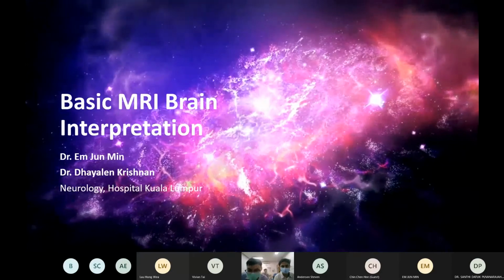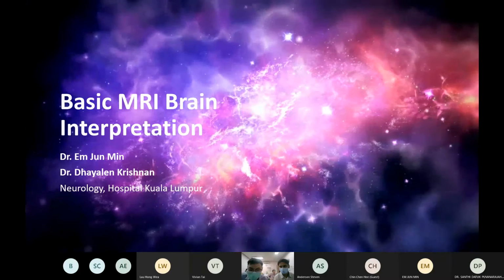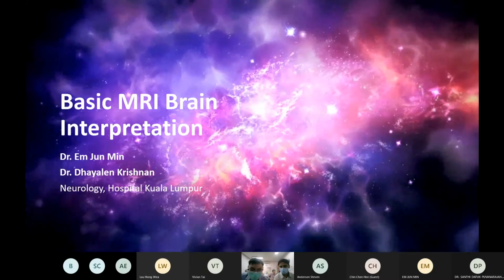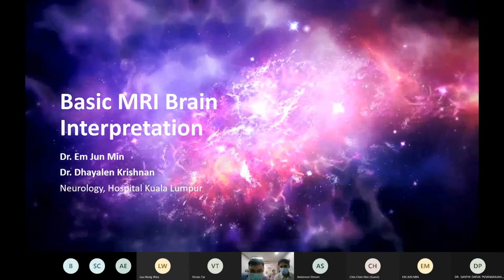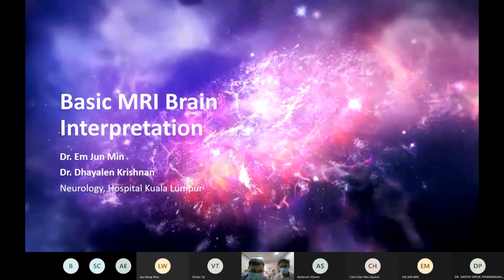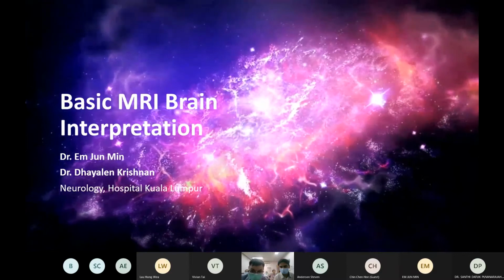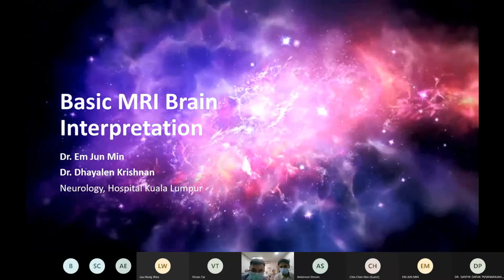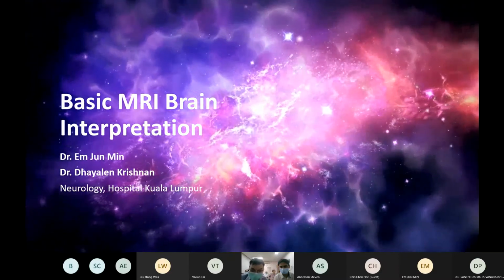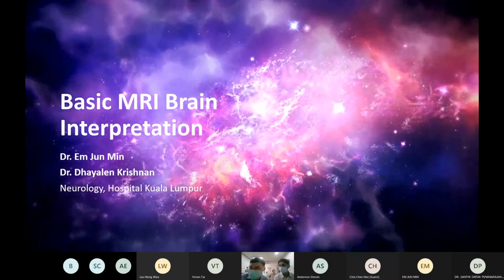Basically, I think it's quite relevant to our setting because after we graduate as medical students and housemen, then become MOs, no one actually taught us how to interpret the MRI, especially the brain, which is important in neurology interpretation. So we're just going to go through a bit of basics, then the approach. Subsequently, we will see various examples and go through various cases. Hope that everyone can learn something from this session, okay?